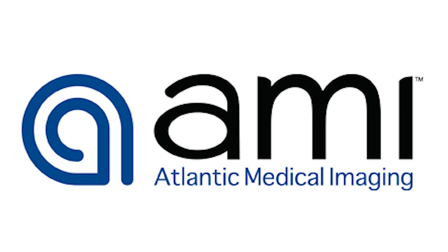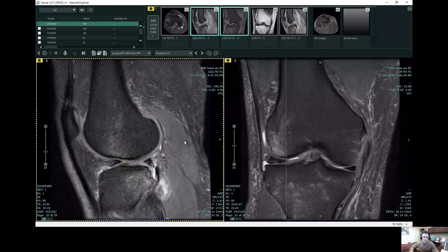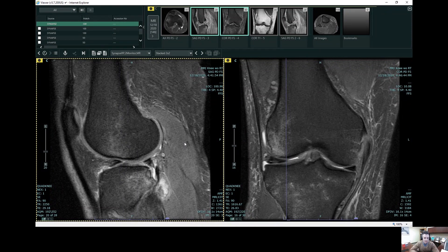Hey everybody, this is Dr. Levy. Wanted to share an interesting case with you. This is a patient who presented to us with knee pain after falling down the stairs. This is an MRI of the right knee — an exam which takes us less than a half hour to do from the time we get the patient in the room to the time we get the patient off the table. Very quick and easy to do.